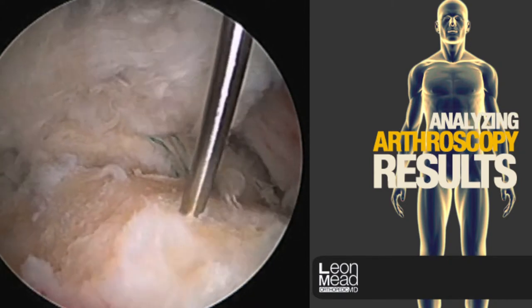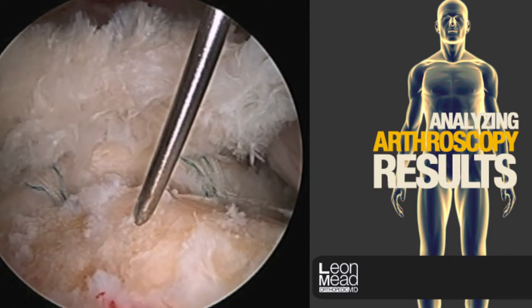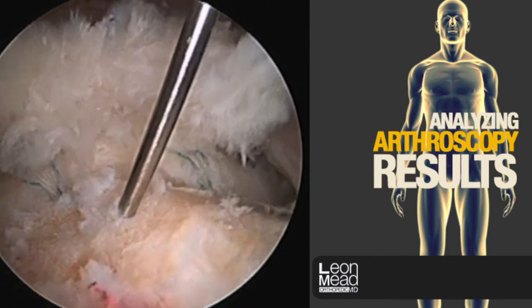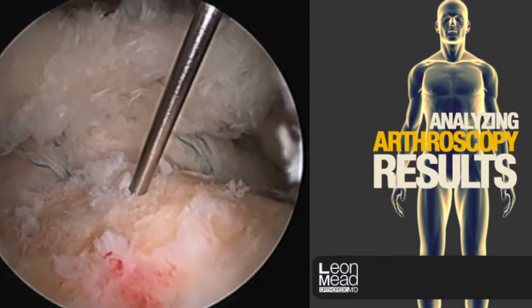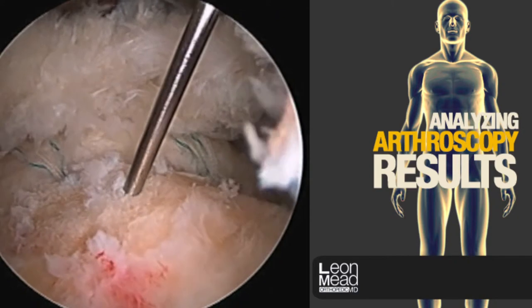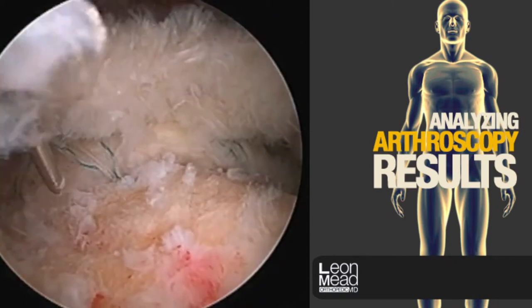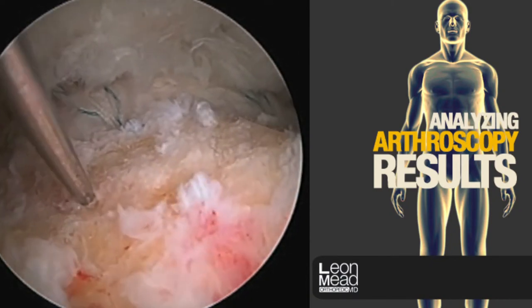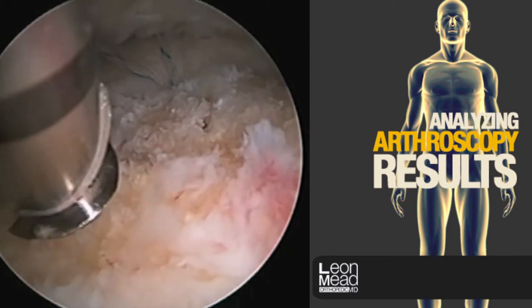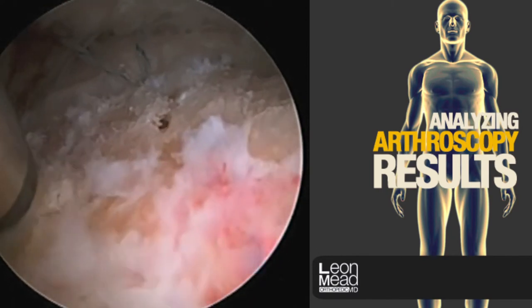This is a spike that we use to create several passageways into the marrow cavity. The bone itself does not bleed very well and is a slowly metabolizing structure. Those who have had the misfortune of breaking a bone know it takes six weeks or longer for bone to heal. By allowing the marrow contents to come into this area, we allow stem cells and other healing cells to help speed and improve the quality of healing.